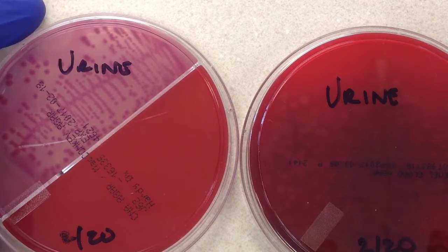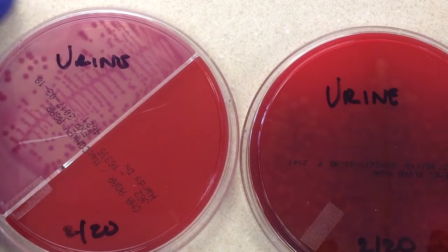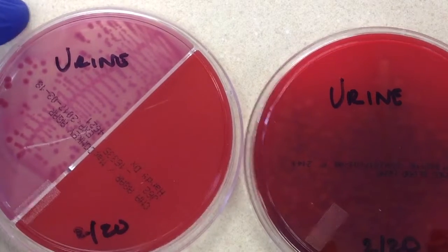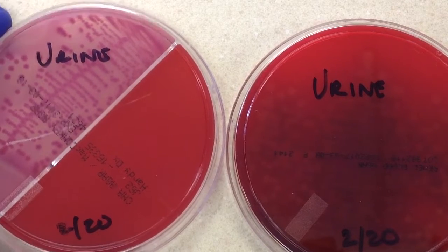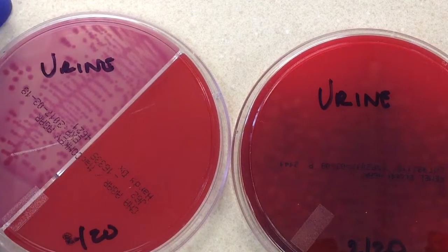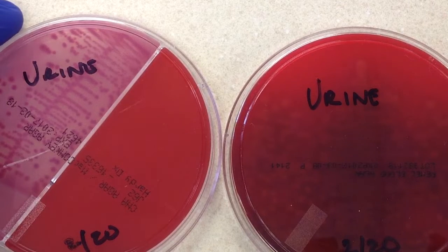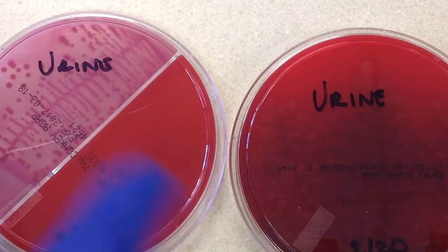Urine cultures are usually reported out with a number. On other videos you'll hear me say rare, few, moderate, many to describe the amount of bacteria, but with urines we use a specific number. We use ranges like under 10,000; 10 to 20; 20 to 50; 50 to 100; greater than 100,000. The label used is greater than 100,000 colony forming units per milliliter, or CFU per mL.